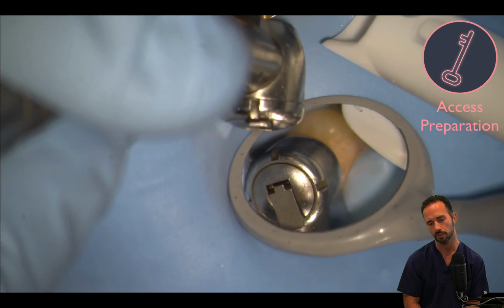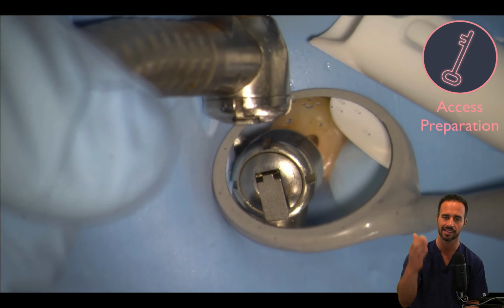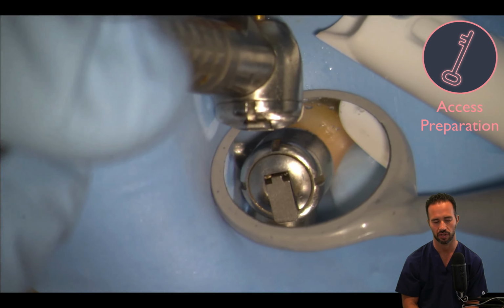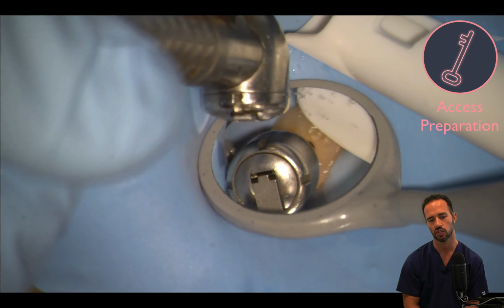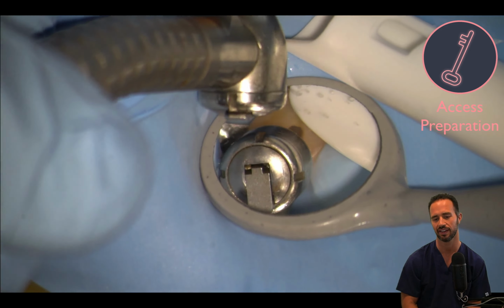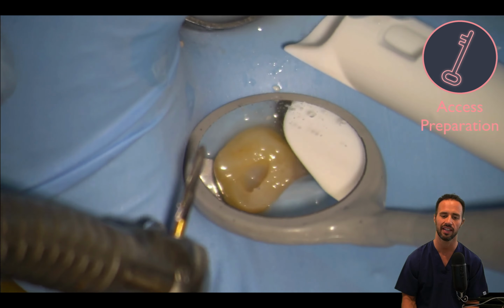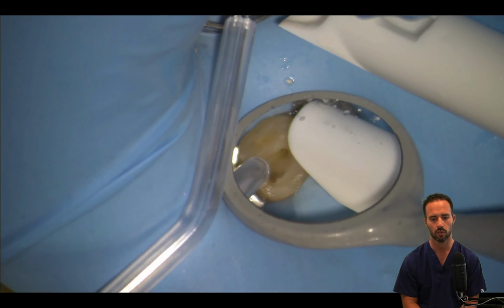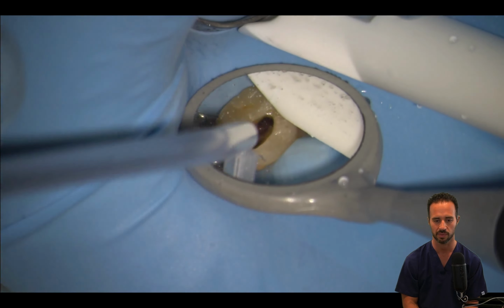Okay, so the Endo-Z bur, as you know, is non-end cutting. It only cuts at the side of the bur, and it's great for smoothing out the access preparation. A lot of these things I'm going to be repeating to you just so you hear it over and over again, and the repetition has a chance to settle in and really stick. So internally, we're going to start noticing a nice smoother outline form with our access preparation.